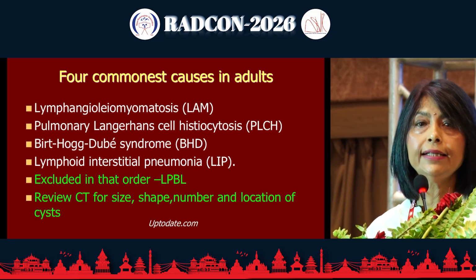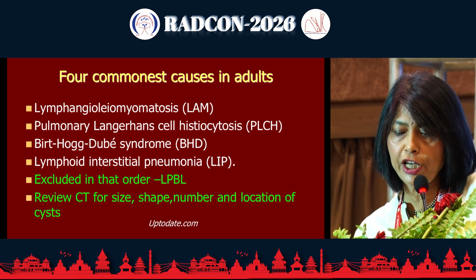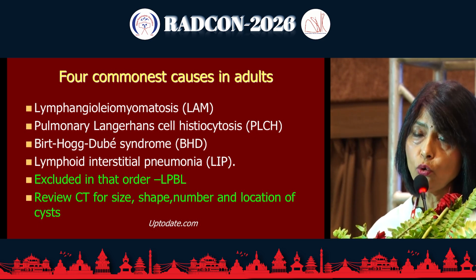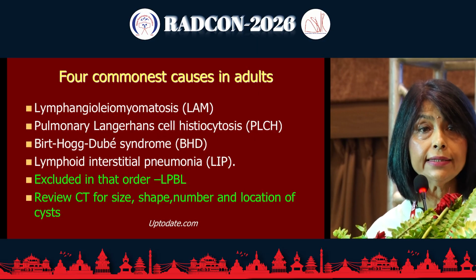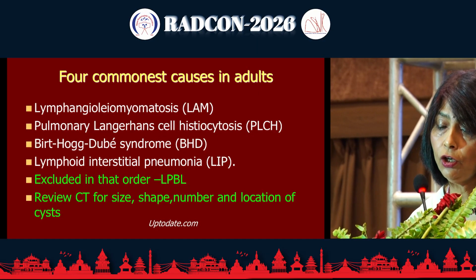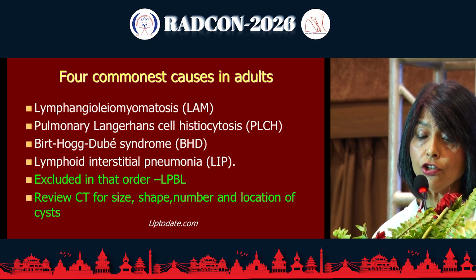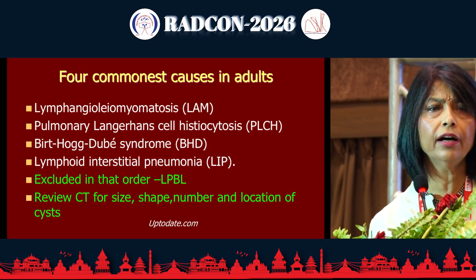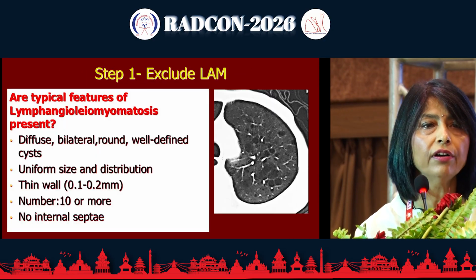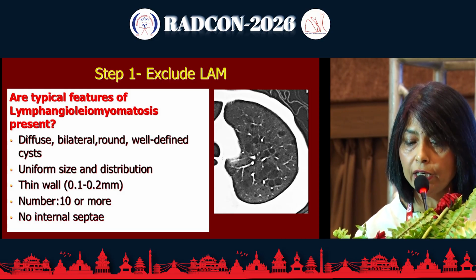and we come to our 4 main cystic lung diseases that we are familiar with and how we will proceed to exclude these. These are all cystic lung diseases, not necessarily cystic ILDs, and what new terminologies have changed also, we'll address some of this as we go along. So it's good to use less English, and when you train AI models also, it's going to be all keyword based. So what are the keywords here?